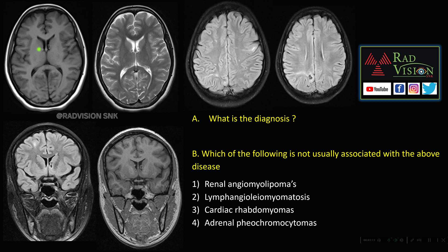Next case: you can see there are multiple subependymal nodules, radial white matter bands, and cortical tubers. There are also enhancing subependymal nodules. The diagnosis is tuberous sclerosis.